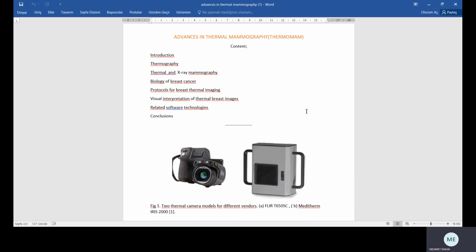Due to these multiple diverse metrics used by the practitioners and no standardized way of interpretation across different expert thermographers, the thermological interpretation becomes very subjective and many times results in high false positives. Many efforts are therefore underway to remove subjectivity using computer-aided diagnostic methods, some of which are described later.